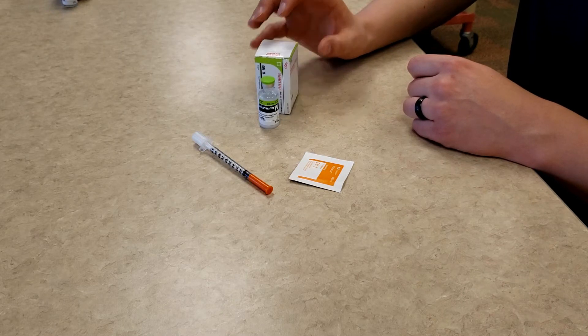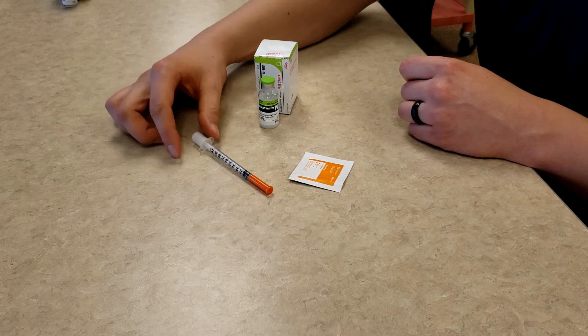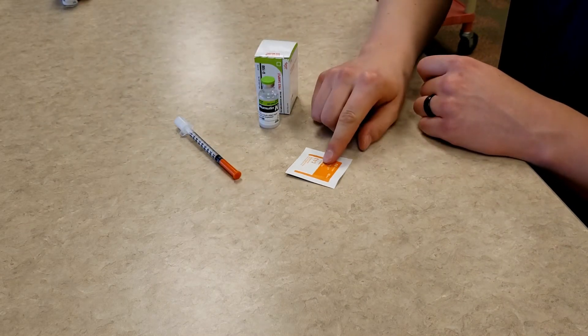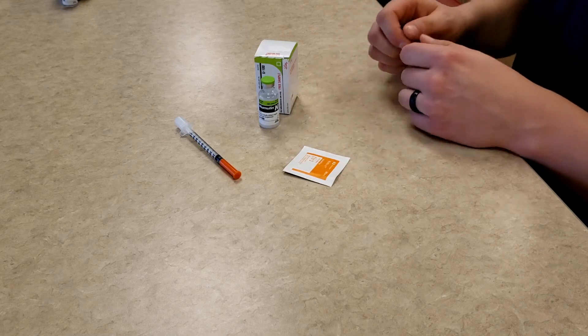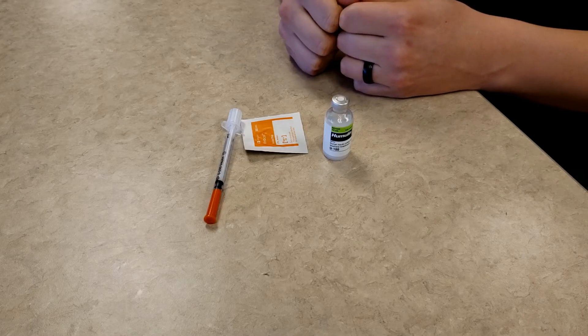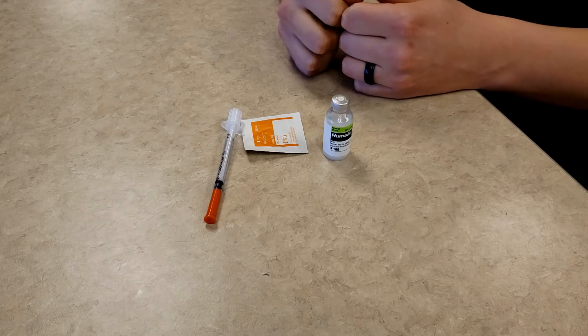The second item you need is an unused sterile insulin syringe. The last item you need is an alcohol wipe. Once you have the correct supplies and you have washed your hands, you can get started.